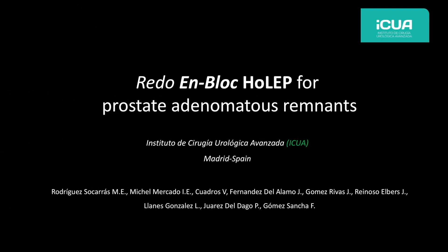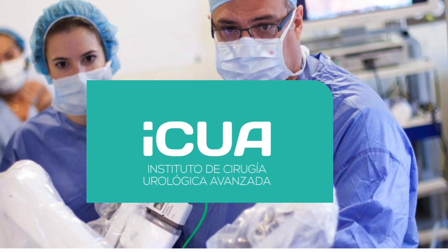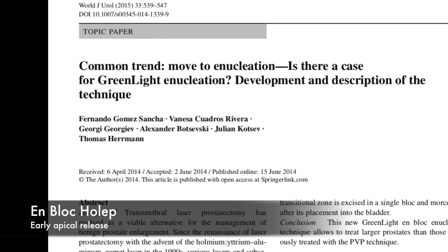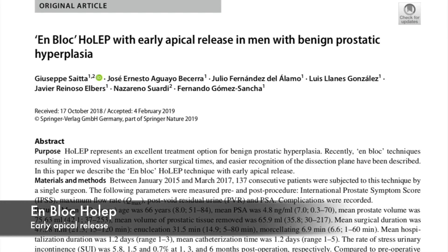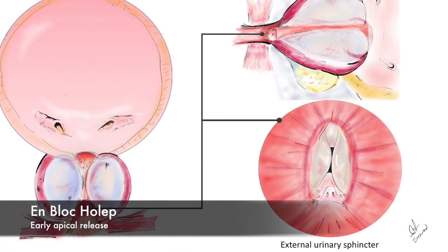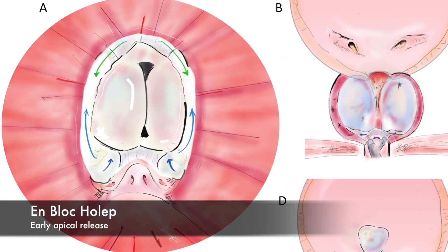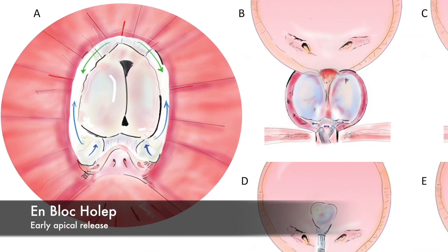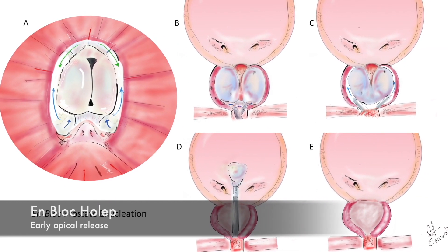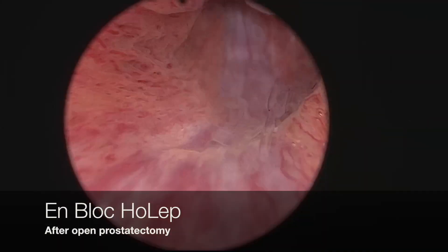Redo nBloc HOLEP for prostate adenomatous remnants. At the ICUA in Madrid we have published an nBloc greenlight enucleation technique, and from there we evolved to an nBloc HOLEP with early apical release in men with prostatic hyperplasia. We present this video to describe the use of this technique where an incision is carried out at the apex to separate the sphincter from the prostatic apex, and then a circumferential incision is carried out to remove the adenoma nBloc into the bladder in previously treated cases.